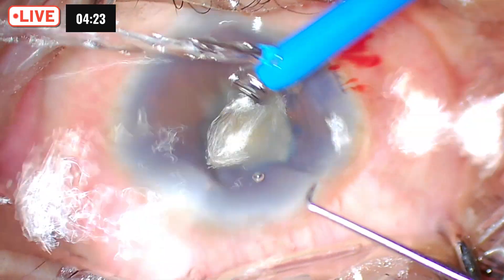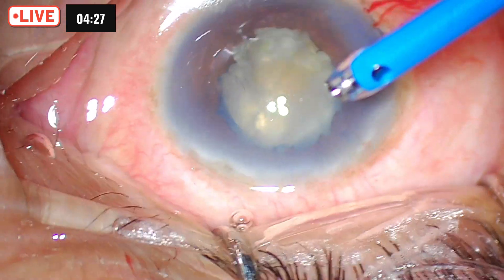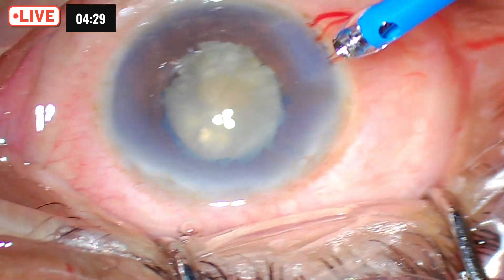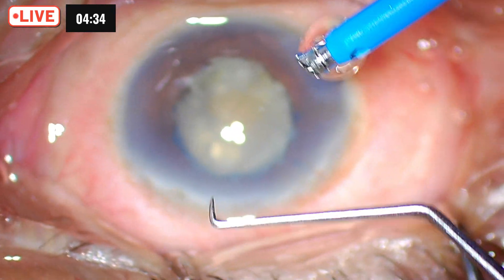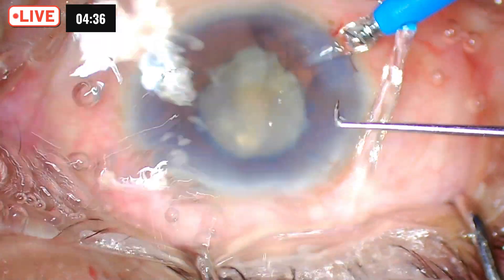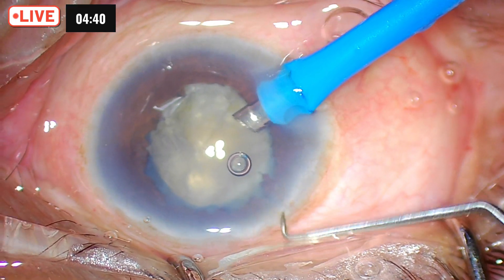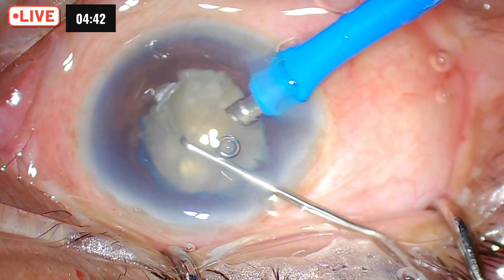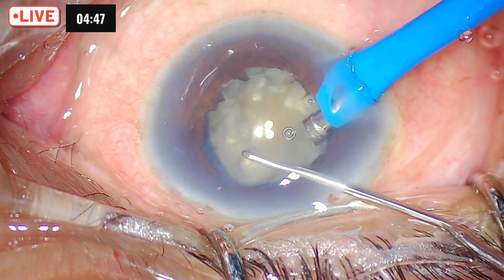Since it is a hard cataract, I will expose the phaco tip more so that I get a deeper hole and penetration. I use a special chopper — I call this a Parshuram chopper. It is a 1.85 to 2 millimeter flange. It does help me create a very, very deep chop. Maneuvering it into the wound is a little tricky, but it does save the day most of the time.